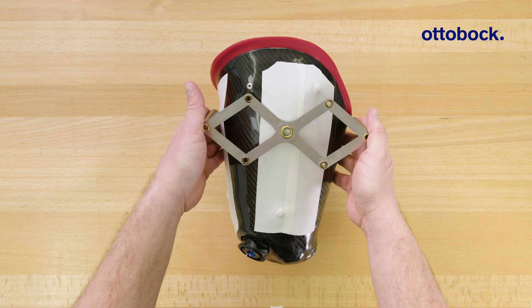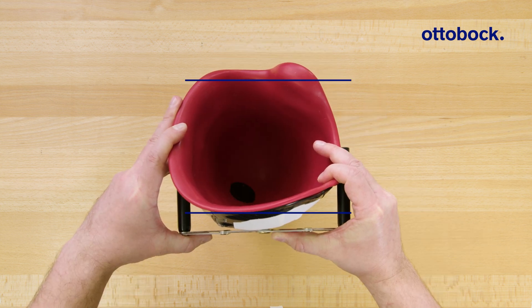Next, use the 50-50 gauge to mark the center of the socket in the sagittal plane.